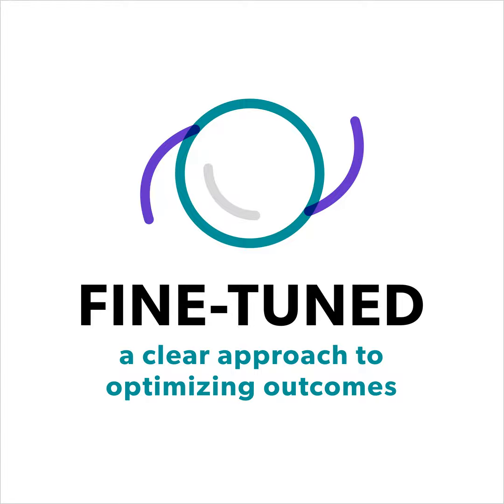However, some disadvantages of SMILE include the slower recovery of uncorrected distance visual acuity and the fact that there is currently no way to enhance a SMILE surgery with an additional SMILE surgery if necessary. I think we are in the very early stages of the SMILE surgery evolution. Right now, there is only one manufacturer with a system to perform SMILE surgery. I know that many of the major ophthalmic companies are working on launching their own SMILE platforms. The addition of new machines and technology will help advance SMILE more rapidly.